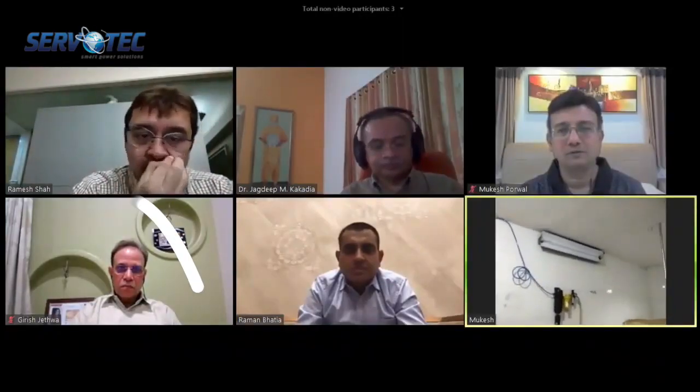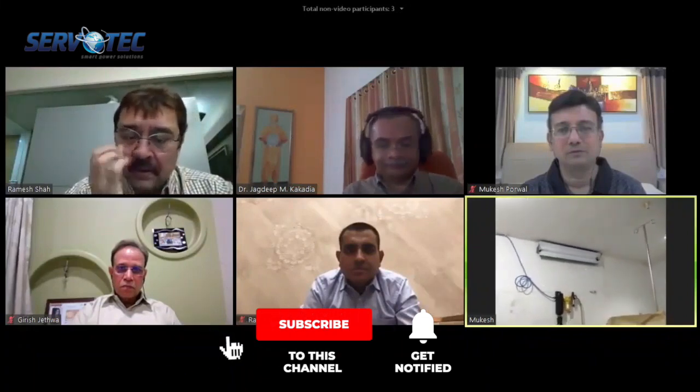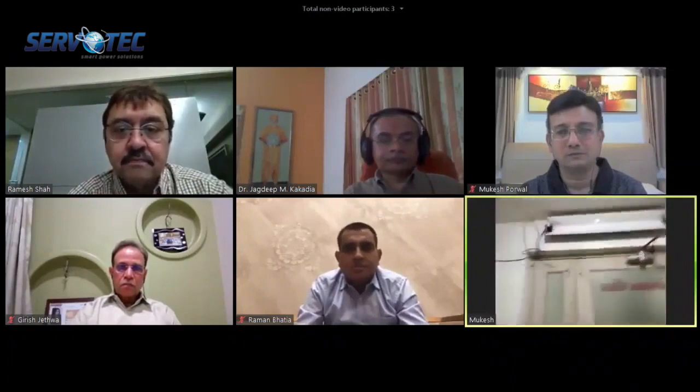I want to show you some of the UV fixtures which I have fitted to my operation theater. As Dr. Kavriya mentioned, this operation theater has had UV light installed for 10 years. This is a UV sterilizer.